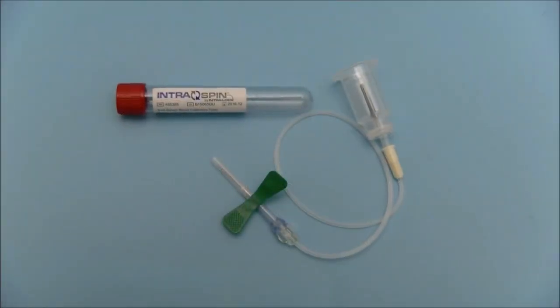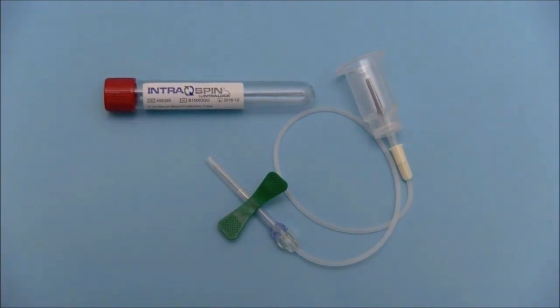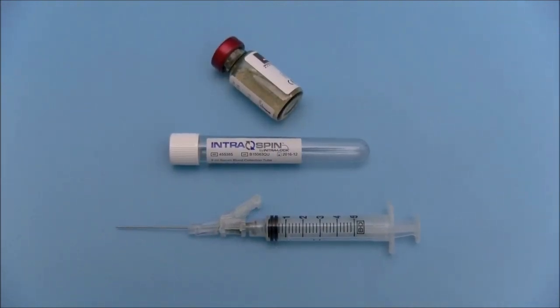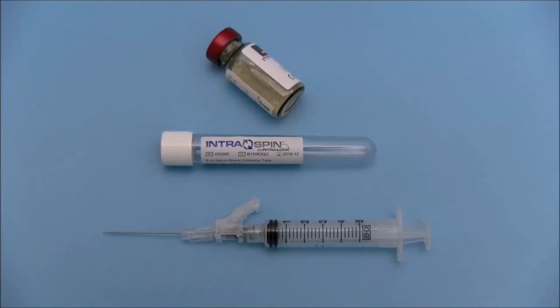Red top intra-spin tubes are used to fabricate LPRF membranes. White top intra-spin tubes are used to harvest uncoagulated plasma that will be added to the bone graft to fabricate PRF blocks.